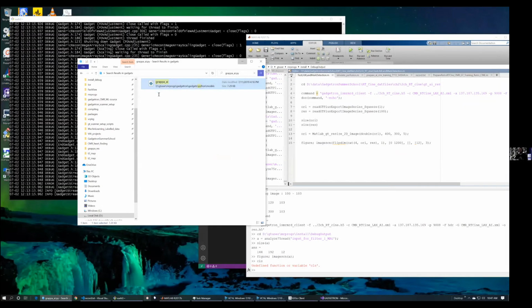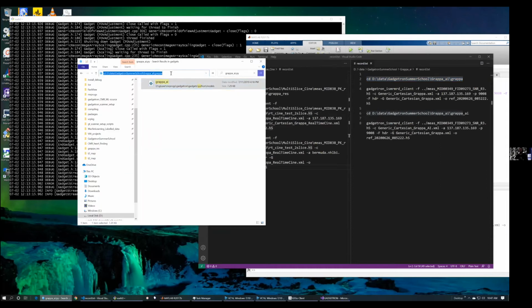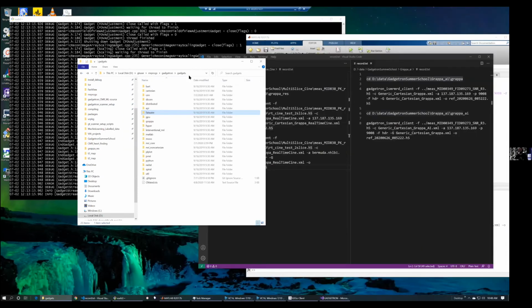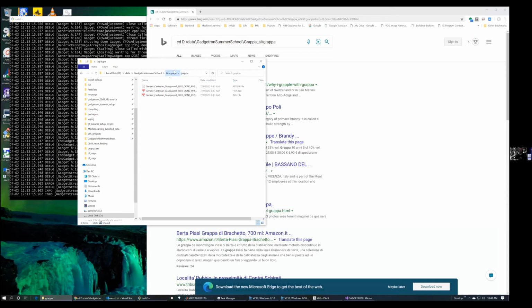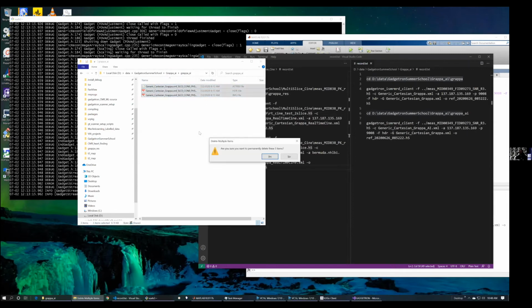So we can run these models, run these examples. I have a small data set prepared. This is just R3 phantom data. I can run it twice. Firstly with the generic Grappa recon. I will delete all my results here. Then secondly, I will run this Grappa AI chain.